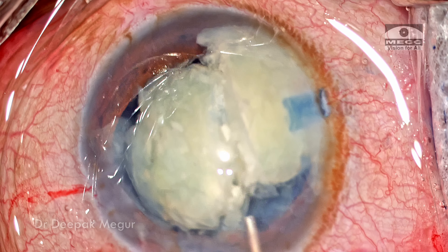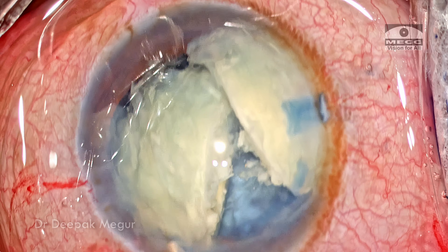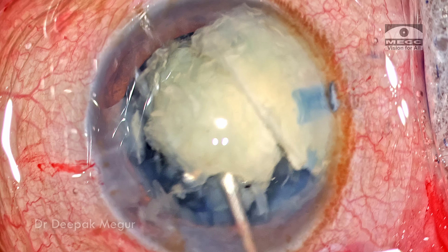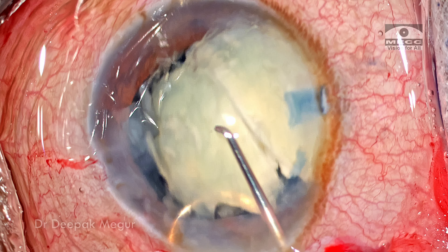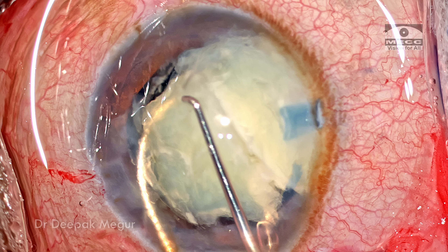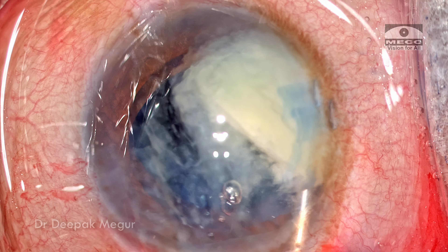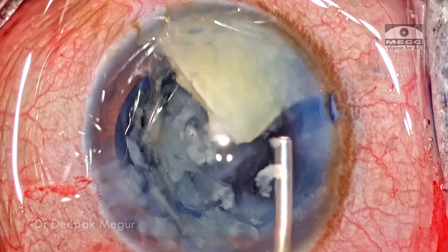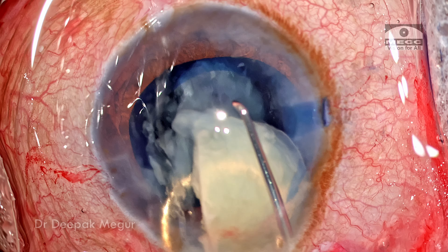I'm injecting OVD into the bisected area to separate the two fragments, and under the cover of OVD each of these pieces is going to be extracted out. I'm going to use a vectis and dialer with the classical sandwich technique. Ideally the vectis should be smaller than what I'm using, but it is working well. The OVD is refilled and the second piece is then again sandwiched and pulled out.